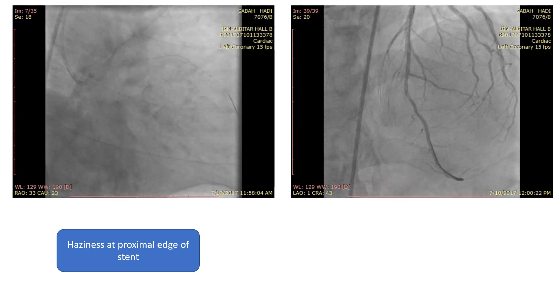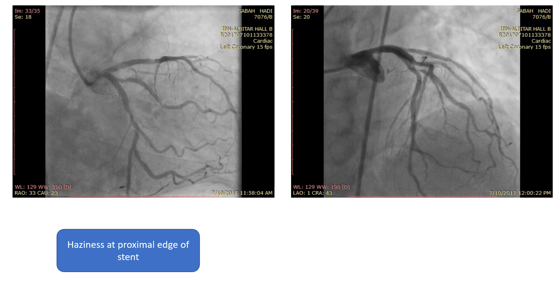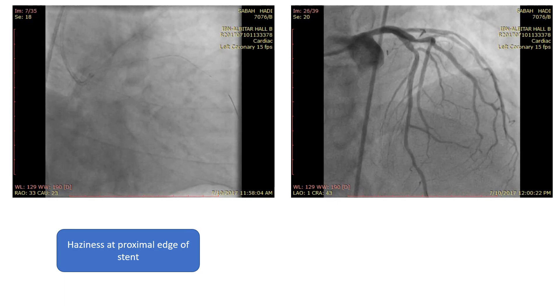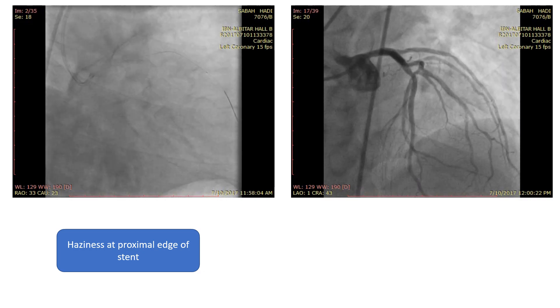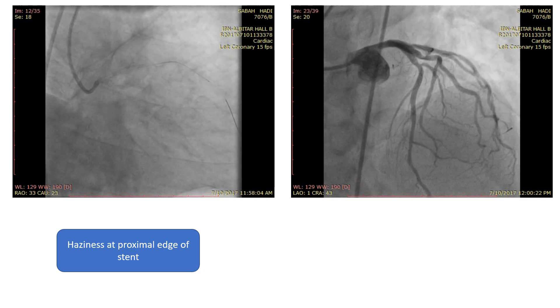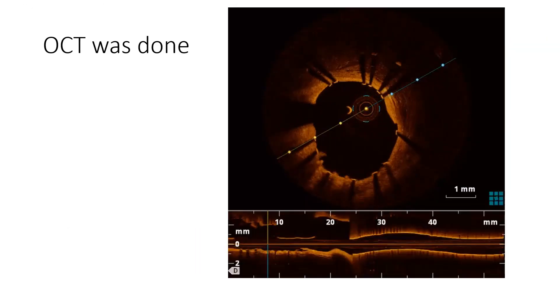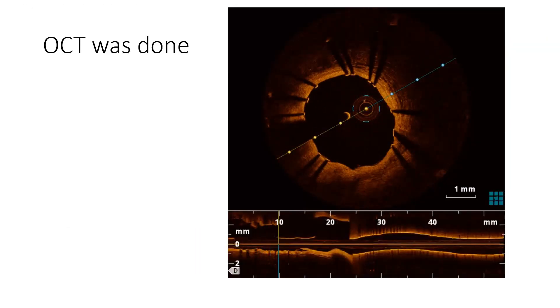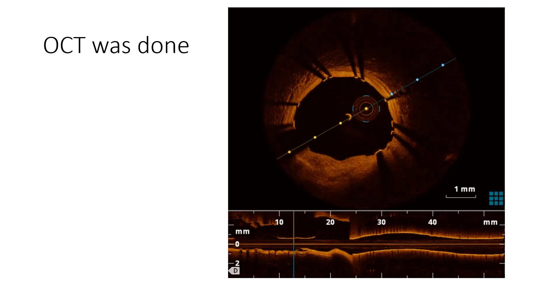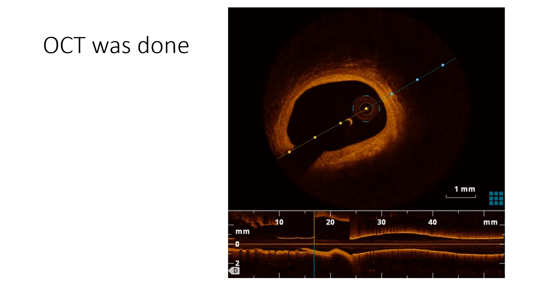This is the result after stenting. We can realize the haziness at the proximal edge of the stent, and now the TIMI flow is 3. To understand what was going on and the significance of this haziness, we did OCT. This is a pullback OCT from the mid part of the stent to the proximal, then to the ostium of the LAD, and then to the left main stem.